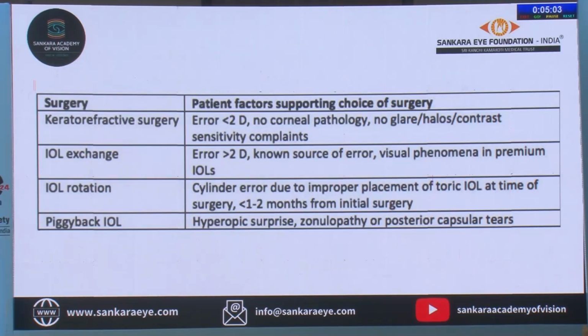So for keratorefractive surgery, that is LASIK, the indication is a refractive error of less than 2 diopters. Yes, I do up to 4-5 diopters. Make sure there is no corneal pathology, no glare, halos, no contrast or sensitivity complaints. That's very important, and more important in these patients, rule out if there is any dry eye.